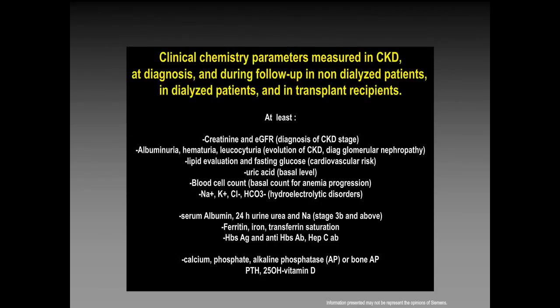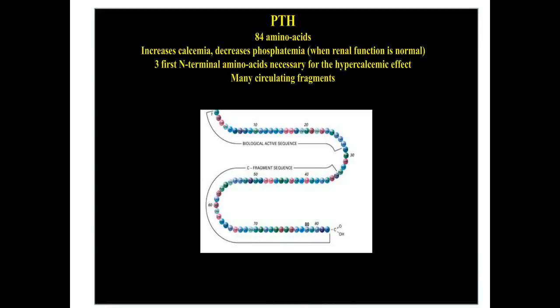But what we're going to focus on most today is these last ones that are here of calcium, phosphate, alkaline phosphatase, and spend most of the time talking about parathyroid hormone and vitamin D. So let me begin by talking about PTH assays.